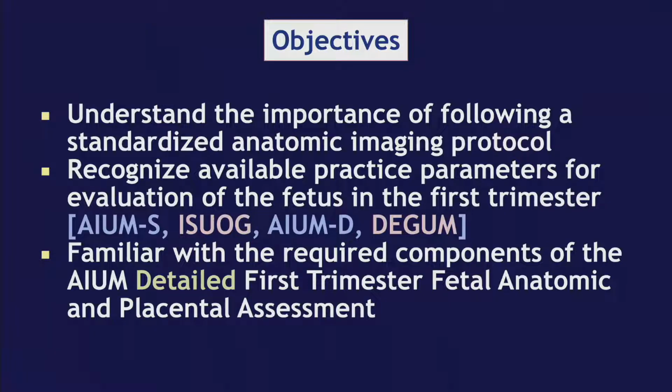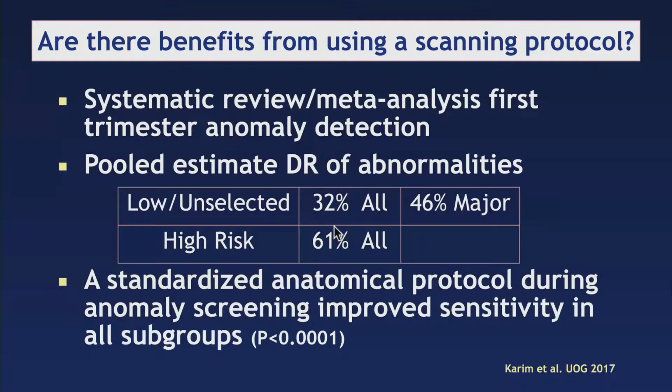By the end of this presentation, I hope you're familiar with the required components of the detailed first trimester fetal anatomic and placental assessment protocols. So why bother with a standard protocol? Many very good practices will say to me, oh, I look for as much as I can see. And yeah, I'm picking up a lot of anomalies.